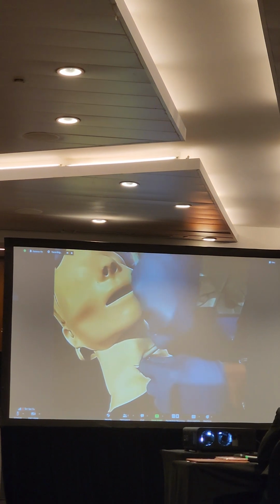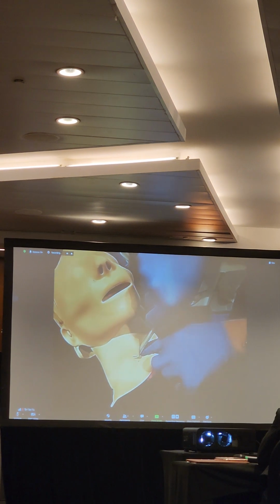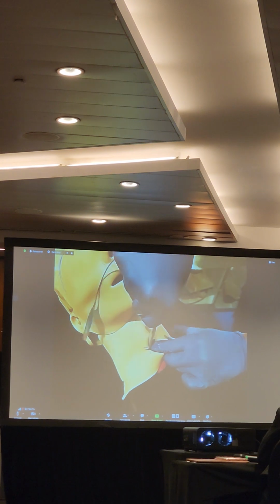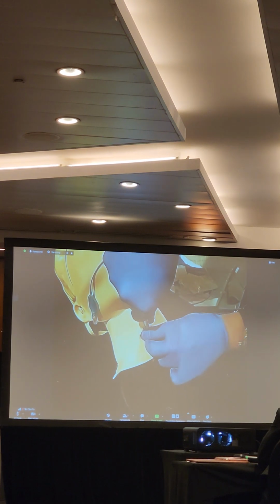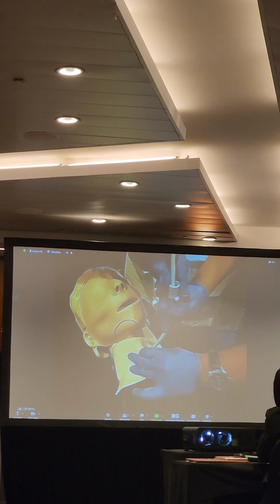In reality, this one would be a bit easier, to be fair, but sometimes you do require a bit of dissection to cut open or to pull open the tissues. Yeah? A bit of rotational movement and you're through. Right? And now we're at the marking over here. Now holding the tube properly, I will ask for the bougie to be removed.